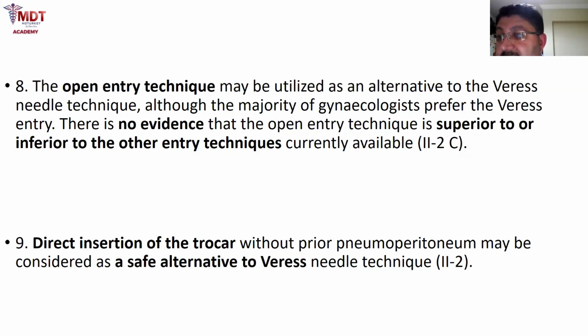These overall complication rates are not real, I think, because they are reported by the advanced laparoscopists. The complication rate of beginner or moderate laparoscopists, we don't know.